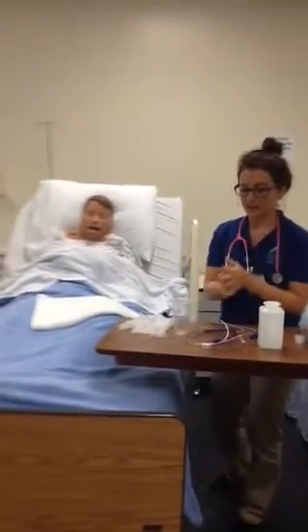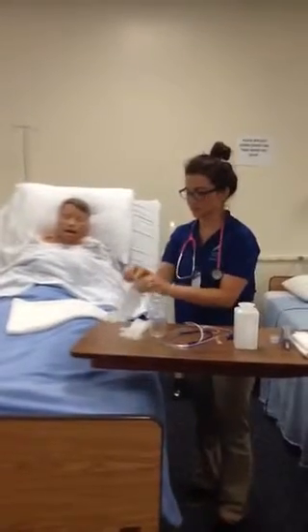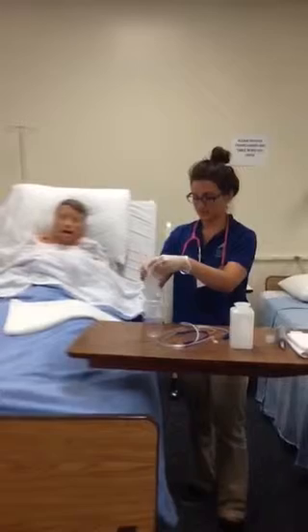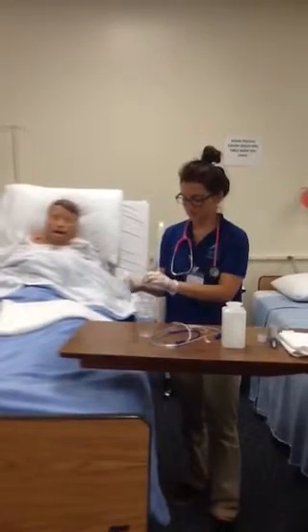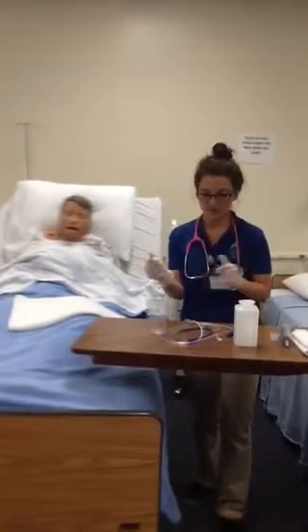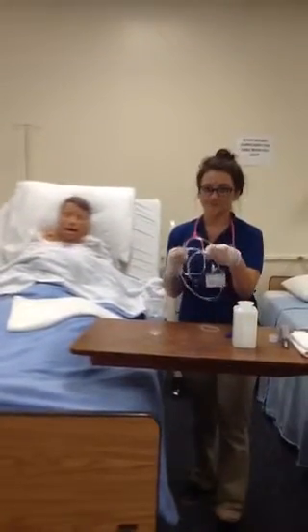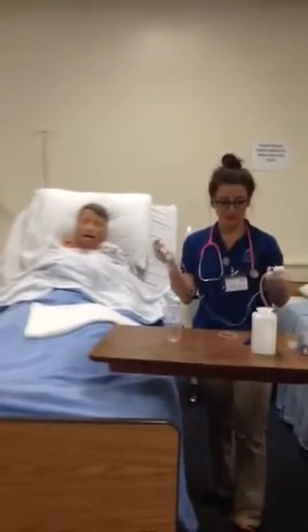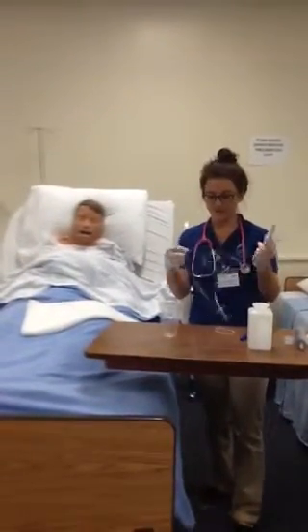Now I'm going to apply my clean gloves, do some hand hygiene. Alright, and I would lubricate 4 inches of the NG tube for easy placement.